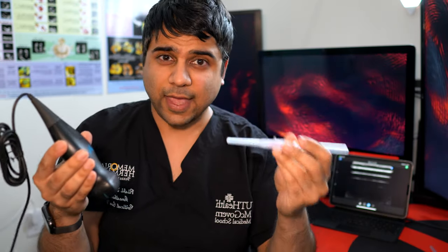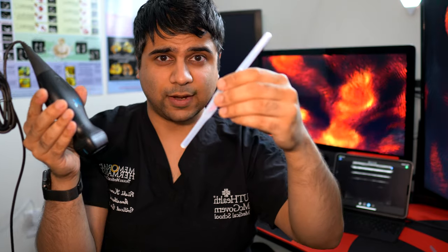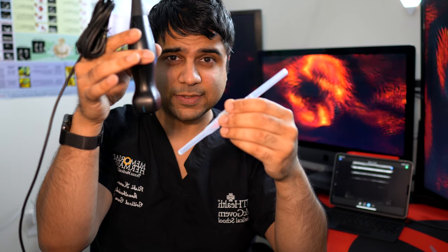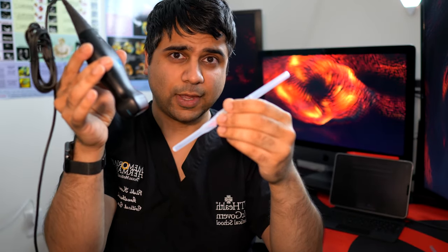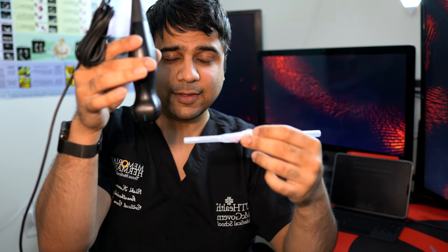Hopefully you found that video helpful. One of the big pitfalls is people move too quickly — they move the ultrasound and the needle at the same time when one should be moved before the other. They don't stabilize their ultrasound with their non-dominant hand. And when you pop through the skin you really want to focus on flattening out. One technique people use is called 'looking back at your needle' — if you're going in at a steep angle you won't see your needle tip well, so you can turn your probe perpendicular. I prefer keeping my probe flat and just flattening out my needle as much as possible.